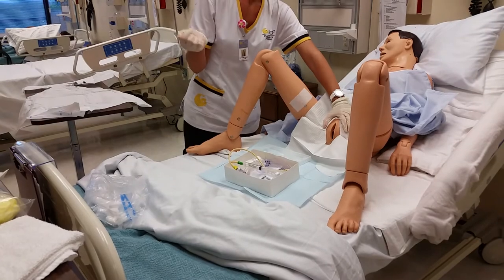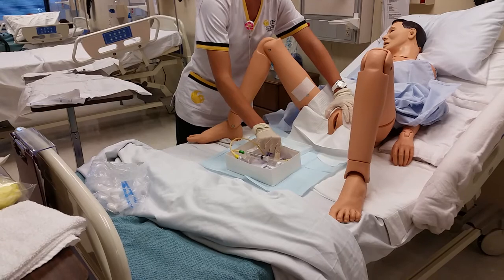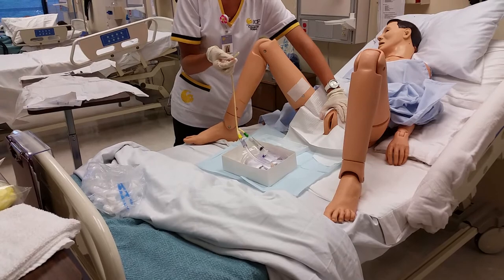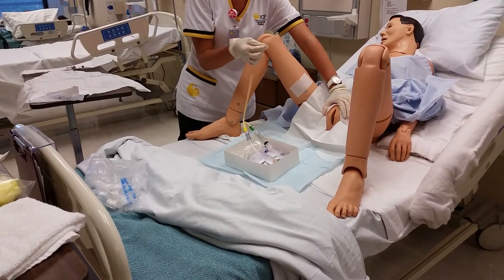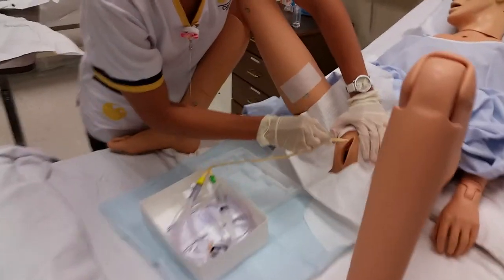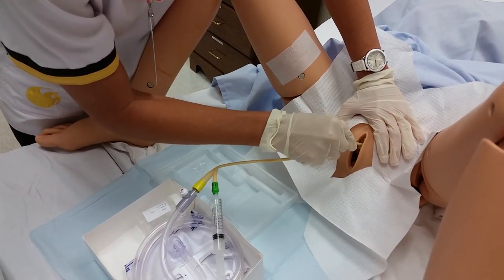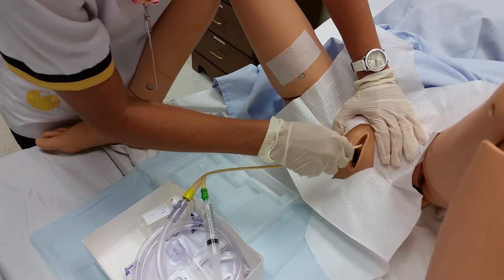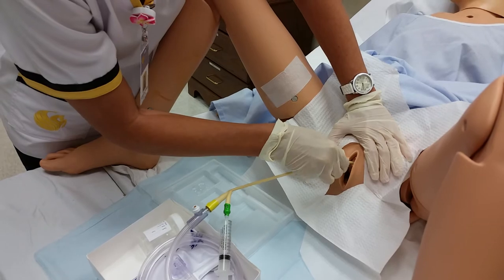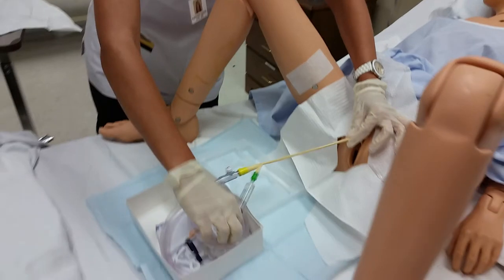I'm gonna drop that. Okay, so now we are ready to place the catheter. I'm gonna go ahead and grab and hold it 2 to 4 inches so I have full control. And as I'm inserting, I'm gonna be careful not to touch the external area. So I'm gonna go ahead and start inserting the catheter. Not touching any of the outside area. And I've just hit urine, so I'm gonna go ahead and advance 1 more inch. I'm gonna use my clean hand to stabilize.